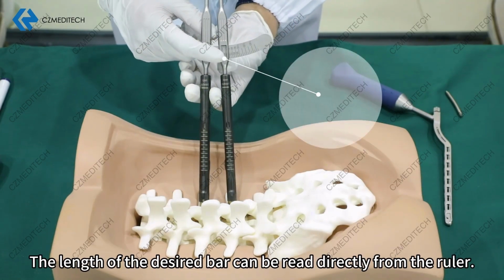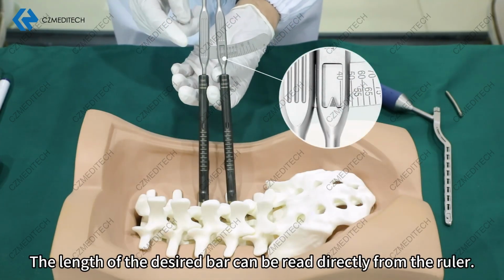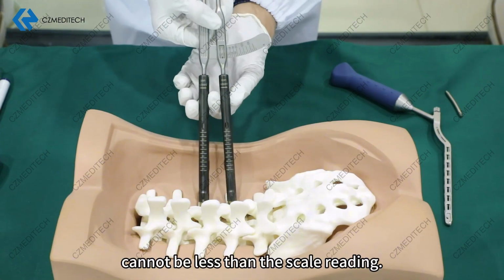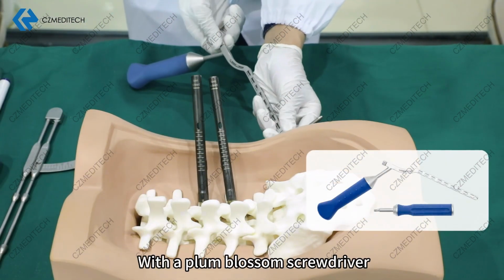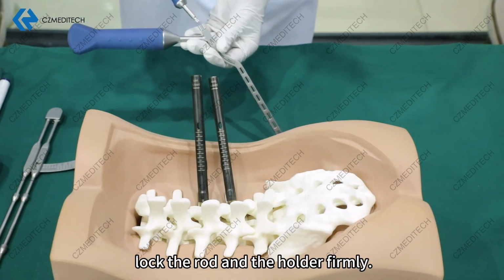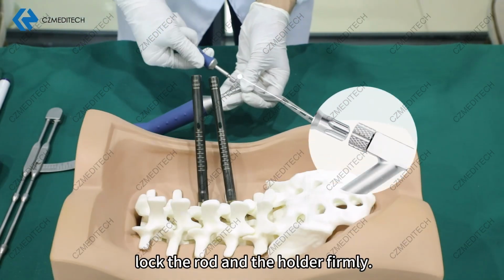The length of the desired rod can be read directly from the ruler. The length of the rod cannot be less than the scale reading. Connect the rod to the rod holder. With a plum blossom screwdriver, lock the rod and the holder firmly.